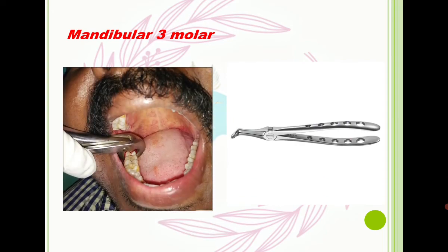The last type is the mandibular third molar forceps. The working part is the same, but like the maxillary third molar forceps, it has a longer handle which helps us better reach and extract the third molar.